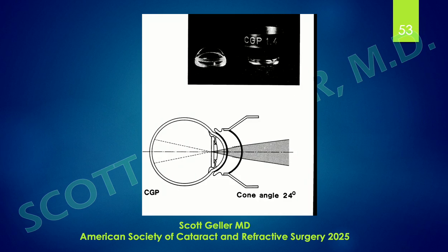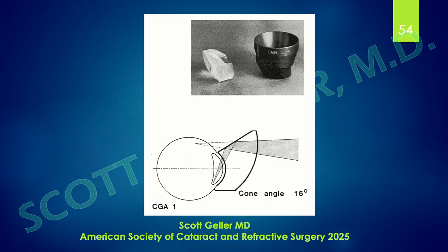My favorite contact glass for capsulotomy is the Lasag, or rather Haag-Streit CGP lens. We use that for capsulotomies. And I also use it for lasering opacities that are just behind the crystalline lens. Not only does it magnify the image, but it creates a much greater safety profile. I'll show you the problems associated with this in a moment.